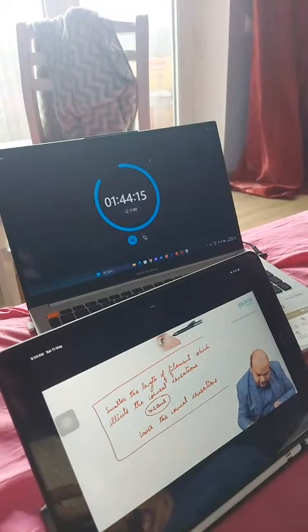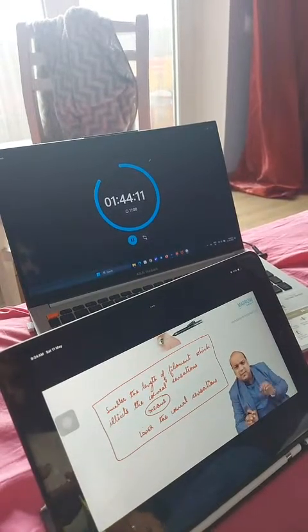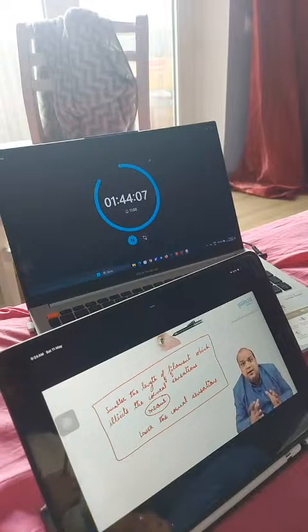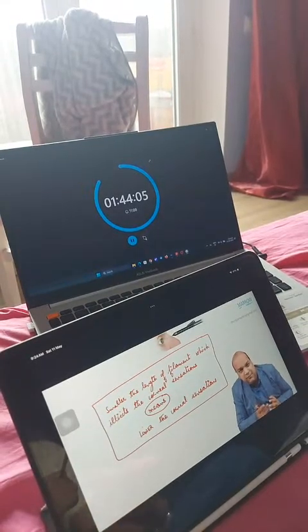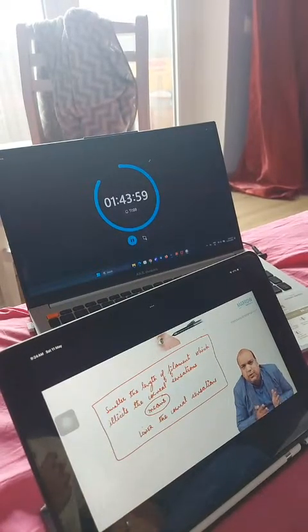I hope you understand this philosophy, yes? If I feel the sensations when a 6 centimeter length of filament is touching my cornea, that means my corneal sensations are intact, absolutely fully. But if I feel sensations at 3 centimeter of the filament distance, that means my corneal sensations are lesser. I hope everybody is clear about the corneal esthesiometer.